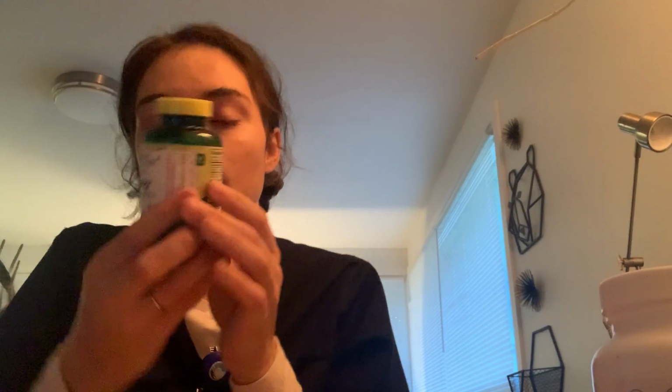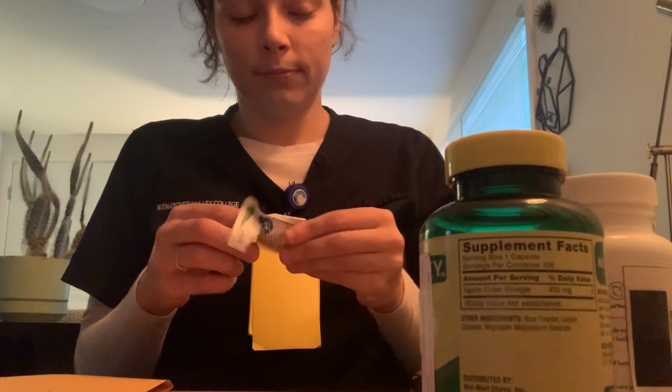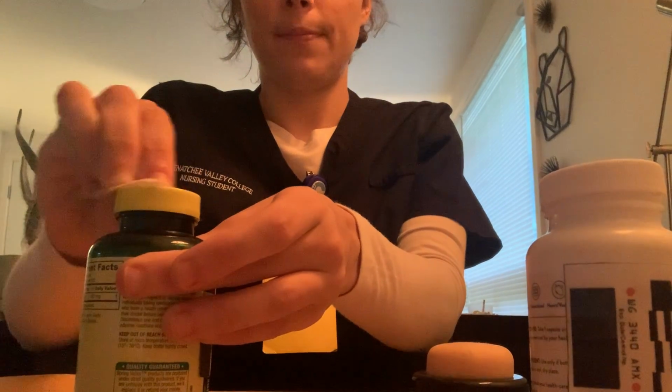We are going to repeat the same procedure with our insulin Lispro. Expiration date, checking to the MAR, any frostiness, clumping, clouding. This should be clear. This will be cloudy. So we're going to mix from clear to cloudy. I'm going to kind of tilt down for this next part. So we are going to take an alcohol swab. We're going to clean the top here.